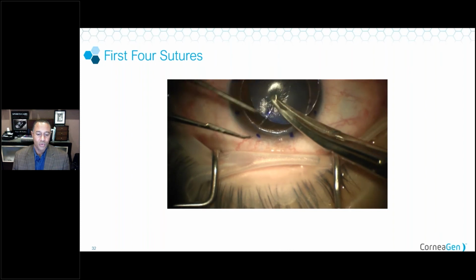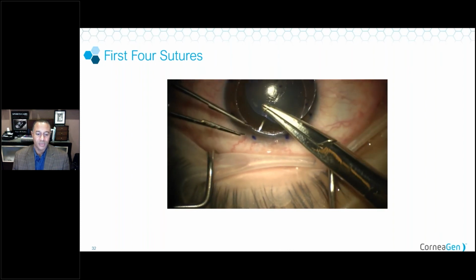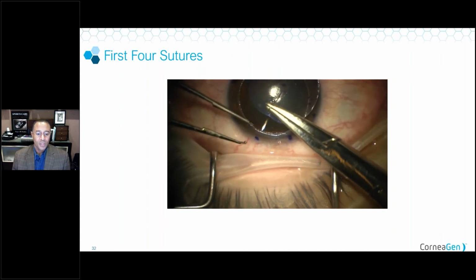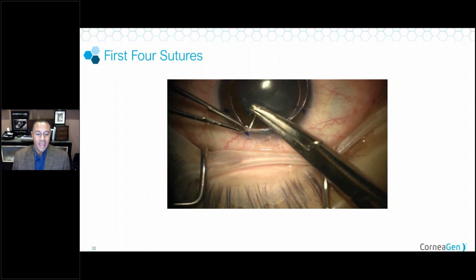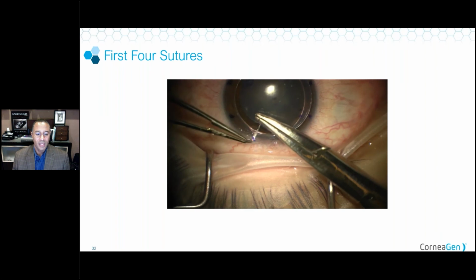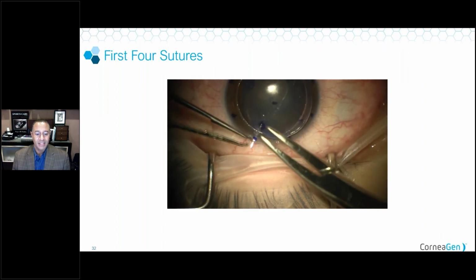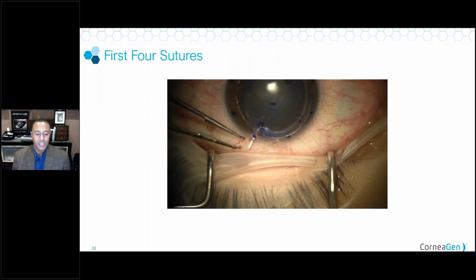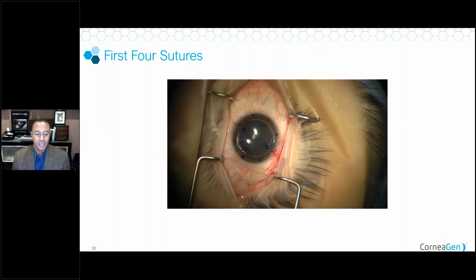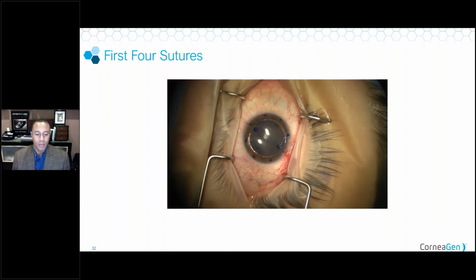It wants to grow down into the interface, and we, of course, don't want that. So we're going to make sure that our suture exits the donor at the edge in the periphery. Then we're going to take a deep bite, shallow bite on the donor, a deep bite on the recipient, and come out just posterior to our mark.